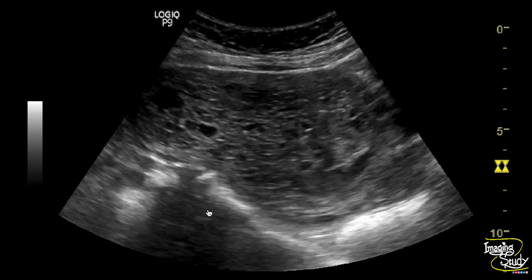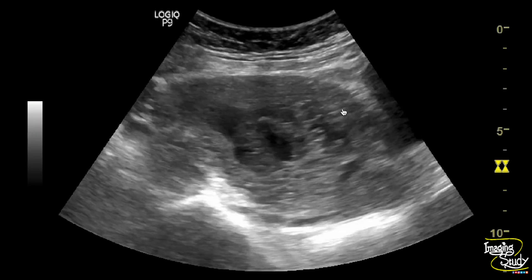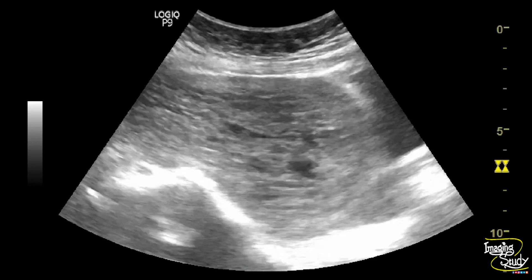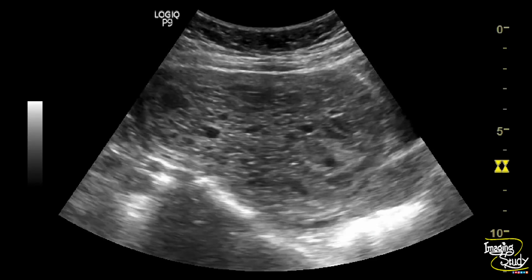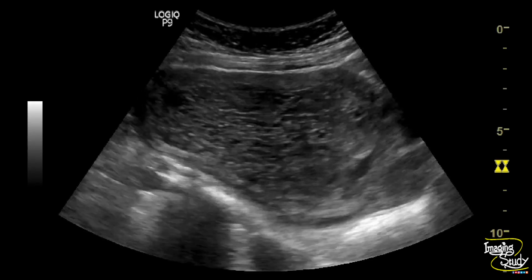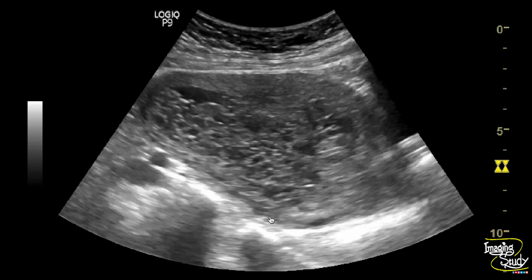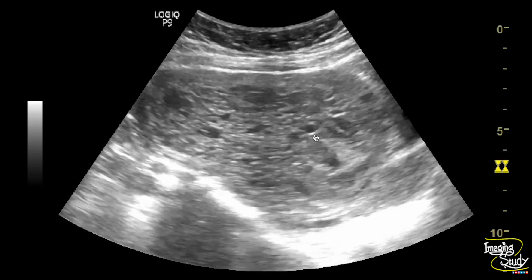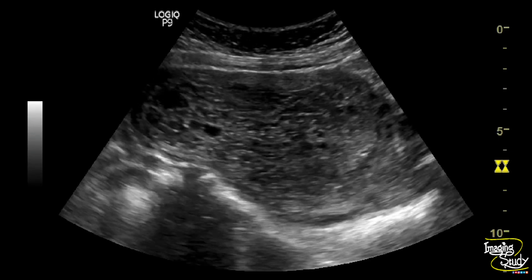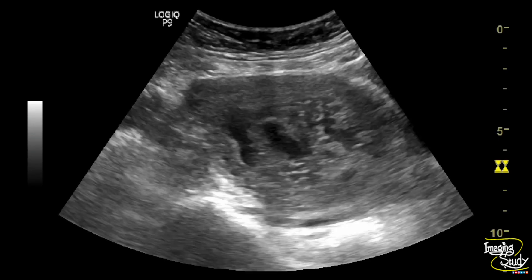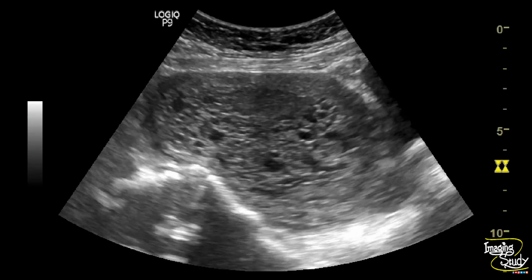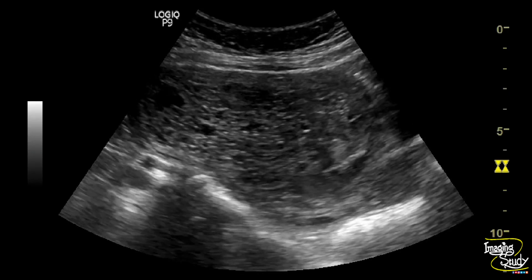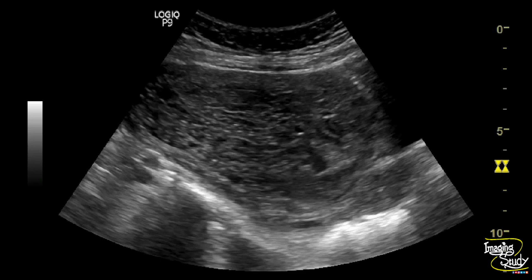Now we want to look for the invasion of this molar tissue. If we look carefully, the posterior myometrium is quite thinner than the anterior one. We need to search for any echogenic exophytic part that extends from the molar tissue to the myometrium, or that may even cross the perimetrium and invade into the adjacent rectal wall or bladder wall. As this is a transabdominal ultrasound, these features may not be well visualized, so we want to apply color Doppler to assess further.